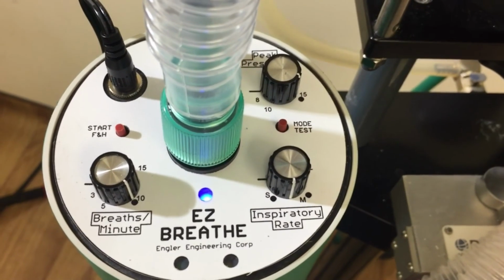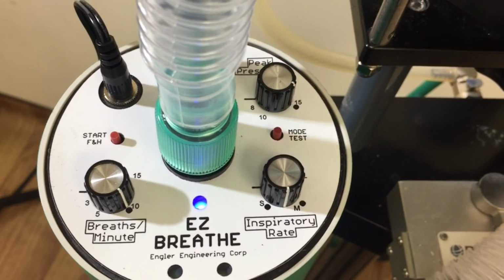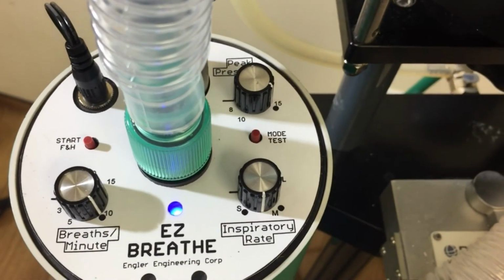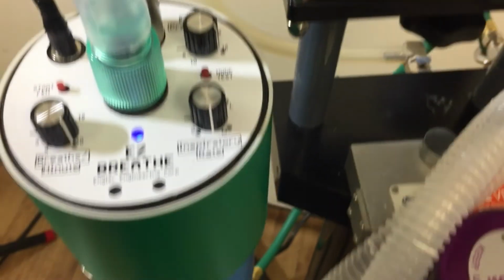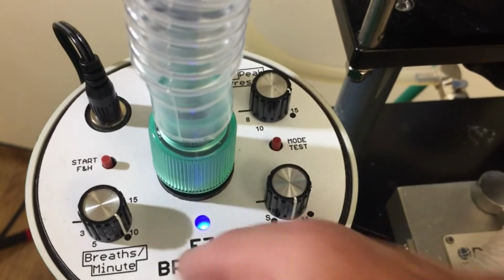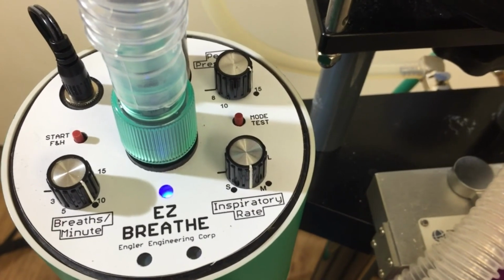The button on the left has two functions. One is to start and stop the ventilator. The other is a fill and hold. To start the ventilator, we press this and immediately release the button. The ventilator will then start. When you're ready to stop the ventilator, simply press the button again and release it, and the ventilator will stop.